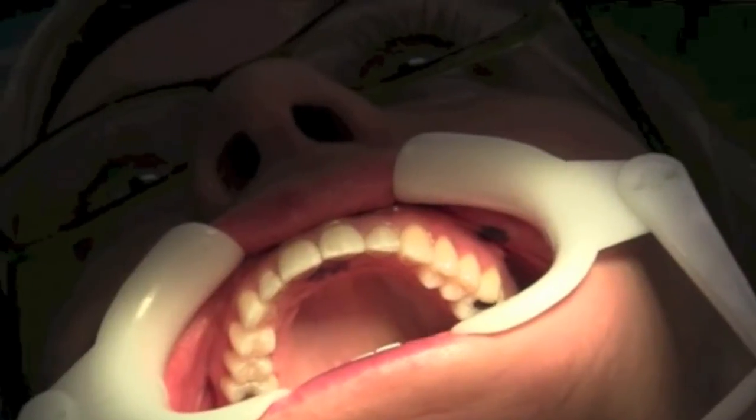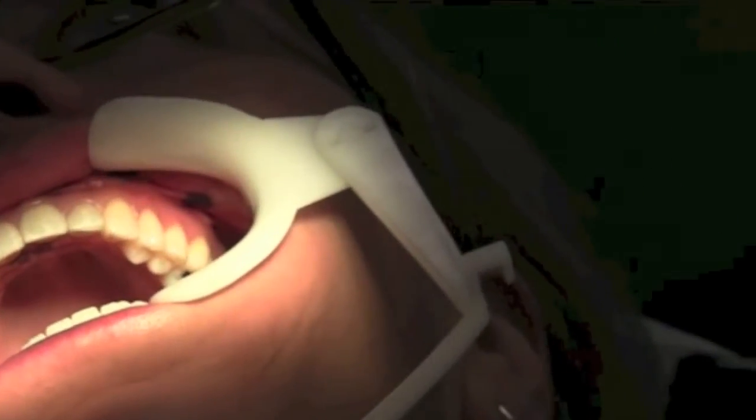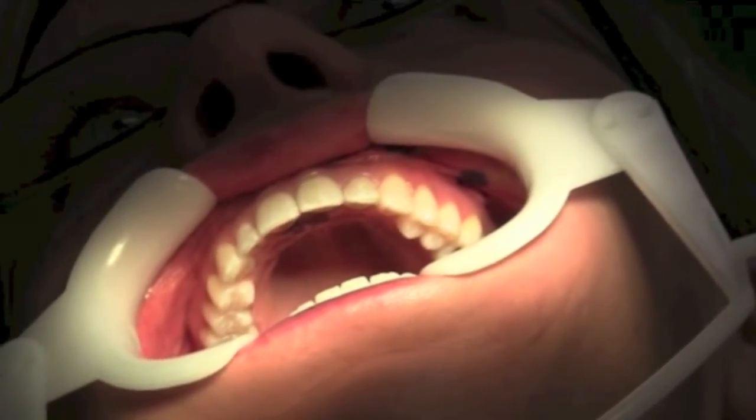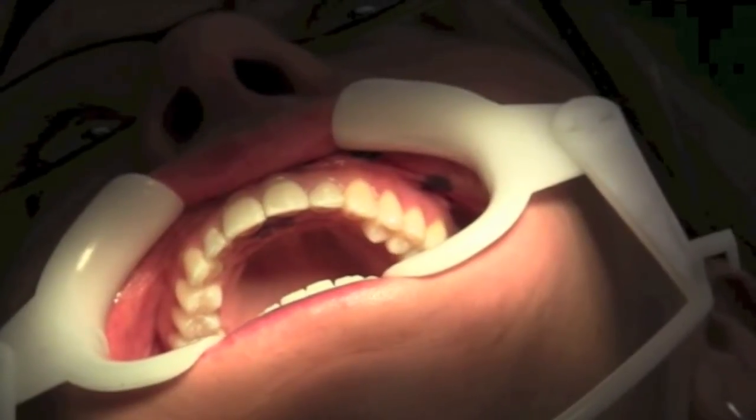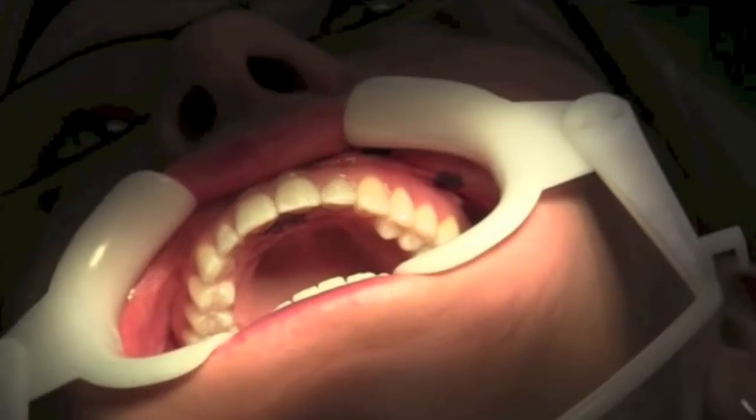The next nerve we are going to talk about is the greater anterior palatine nerve. The landmark is palatal to the 7. A short needle is used. It affects palatal tissue from the 4 to the 8.